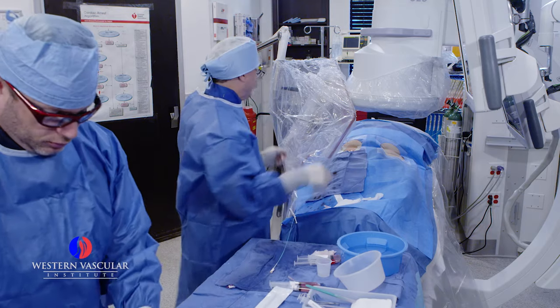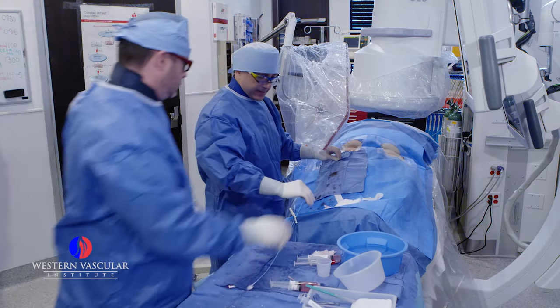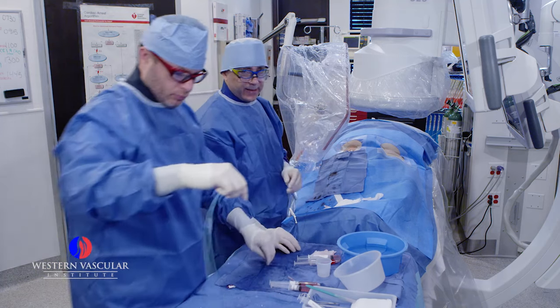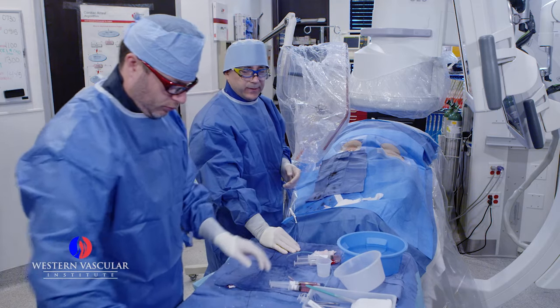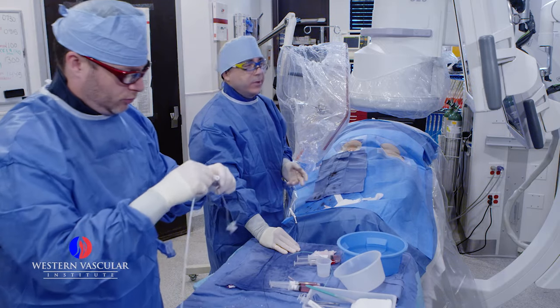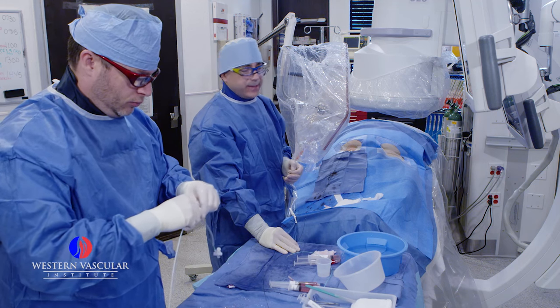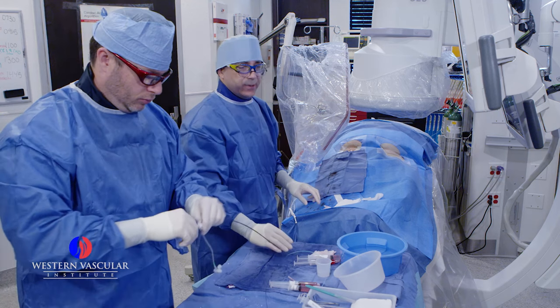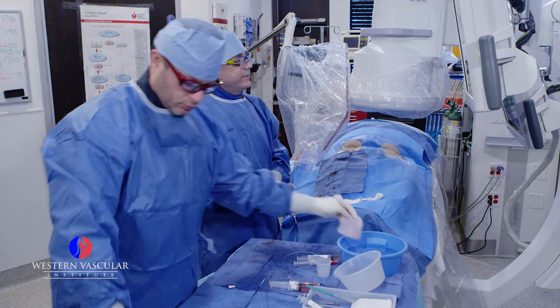We're going to use a laser to treat the area inside the stent that's re-narrowed. I should mention that the inside of the stent forms a different type of plaque buildup than the normal artery does. The inside of the stent forms what we call intimal hyperplasia. That's basically a reaction to the metal that's inside the artery where scar tissue tends to form, and that scar tissue can actually obstruct the inside of the artery. We're going to go after that today and treat that.